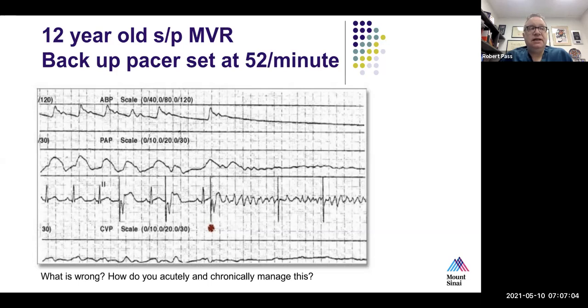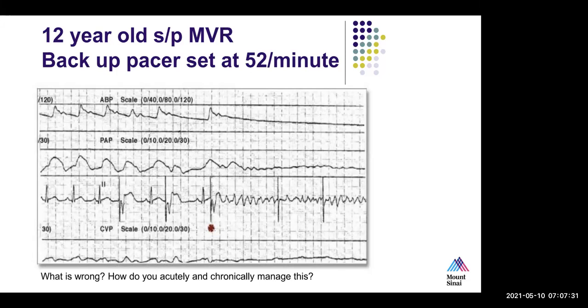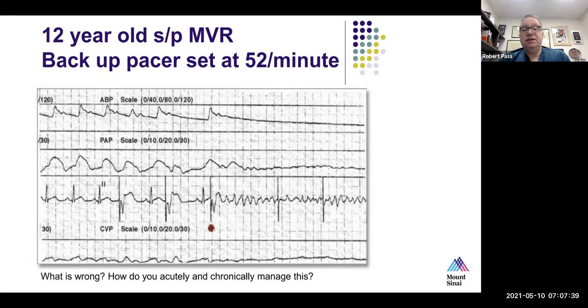And so how would you then tell what the sensitivity threshold is? When we're testing the sensitivity, we're trying to determine the size of the ventricular electrogram. At what level do we no longer sense? So what would you be doing to the number on the sensitivity channel as you're trying to determine the sensing threshold in this patient? So I believe you're going to increase the number until you're no longer seeing the light flashing or the pacemaker starts to pace. That's right. And that would basically be an indirect indicator of the size of the ventricular electrogram.